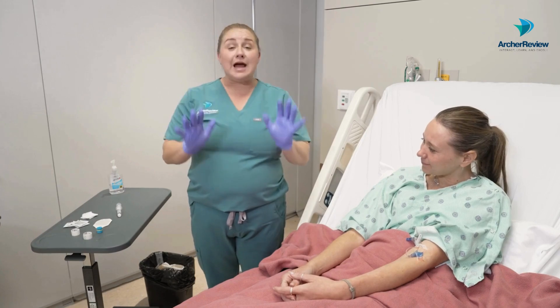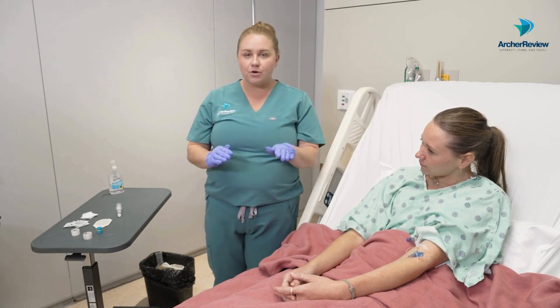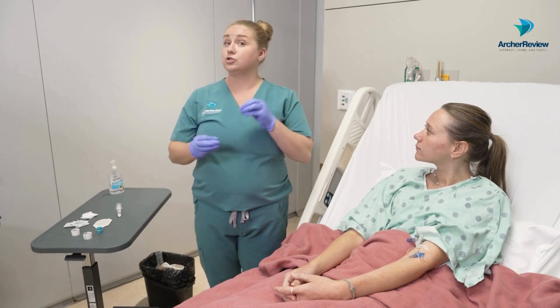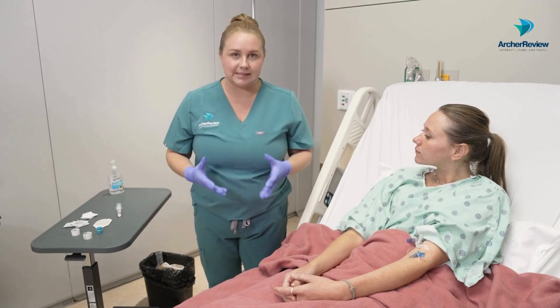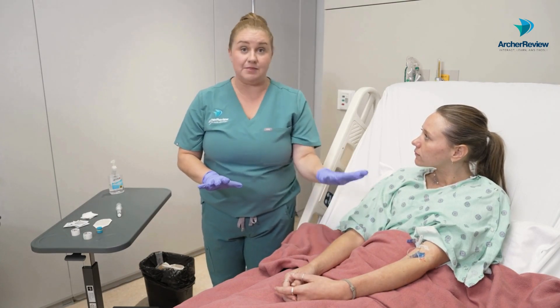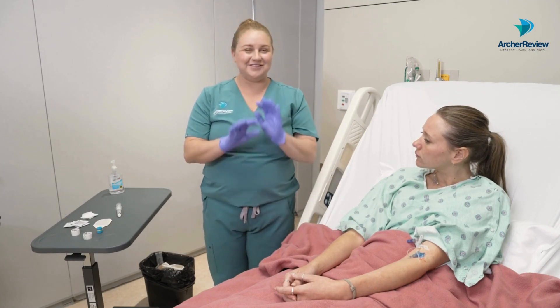Perfect. Now let's gather up all of our supplies. This one is pretty straightforward — you've already got the IV in, so you basically just need the new dressing and some alcohol swabs, because we want to really clean that site up to make sure we are preventing any sort of infection. From there, let's go ahead and do hand hygiene and don clean gloves.